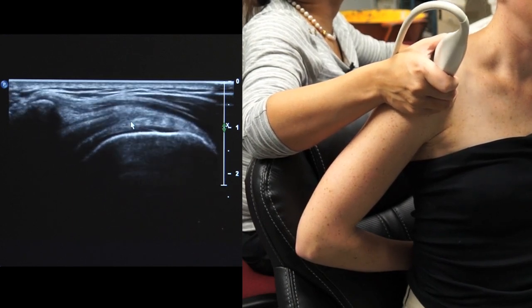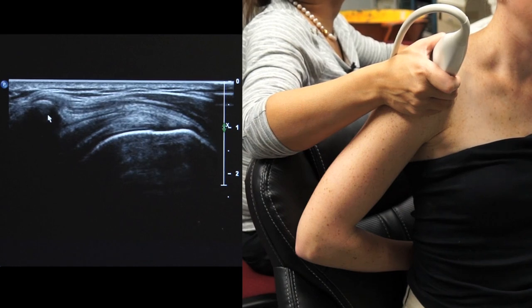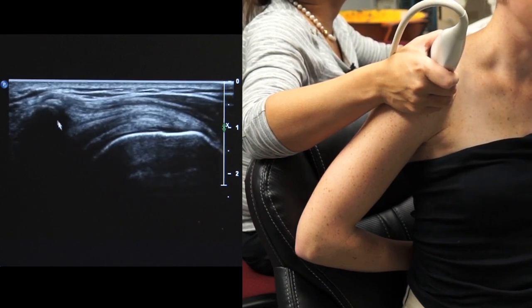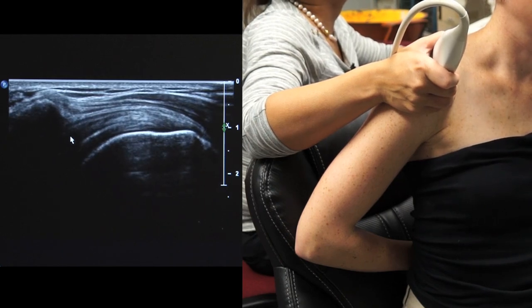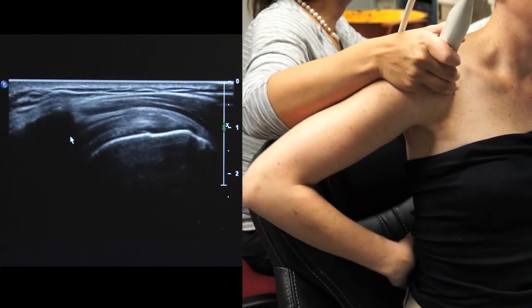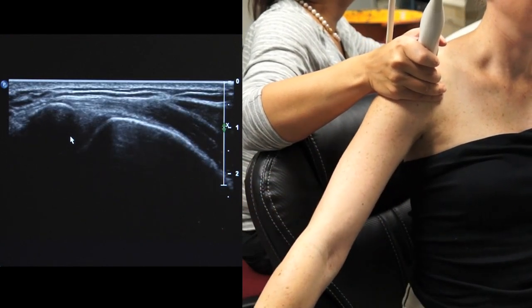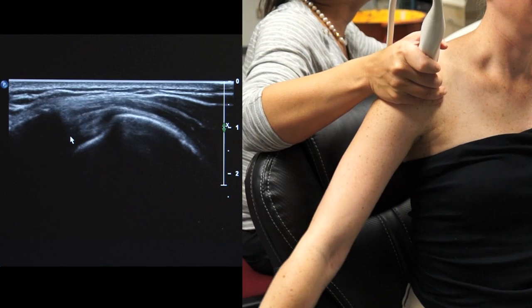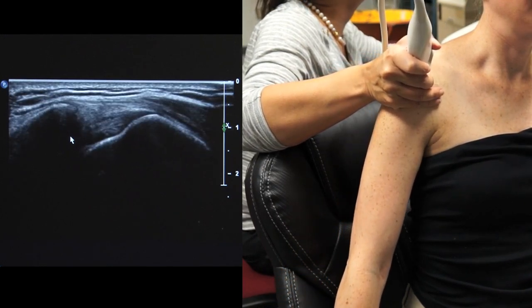And another thing we can do is check for impingement, because impingement occurs in this small space here between or underneath the acromion process. You can have the patient extend their arm and place their thumb down, okay? And we can have them elevate and lower their arm and see the motion of the tendon.